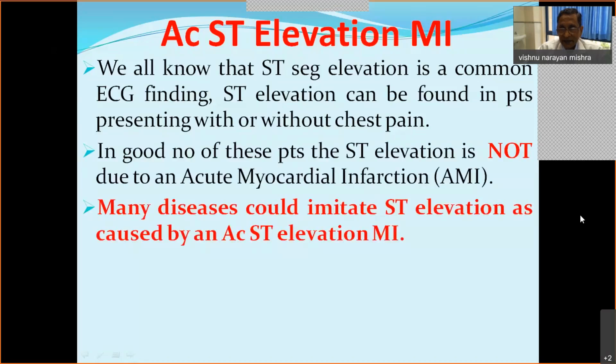That is why it becomes extremely important to know what the diseases are and how we can differentiate ST elevation caused by MI from ST elevation because of other causes. The ECG may look like an ST elevation MI and it may mask other etiologies. We will discuss some clinical and ECG interpretation techniques for identifying ST elevation MI mimics. Before going to that, one has to understand how to see the ST segment.